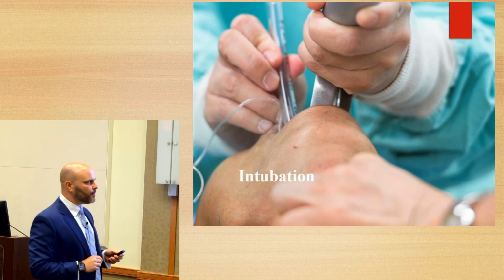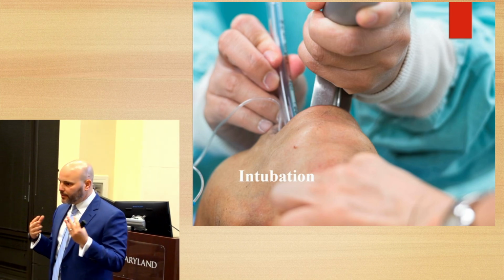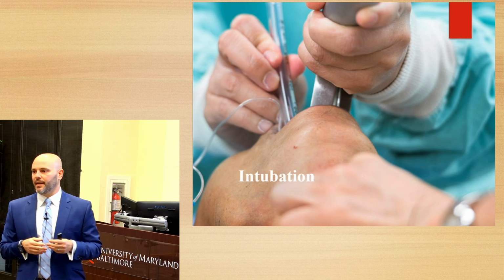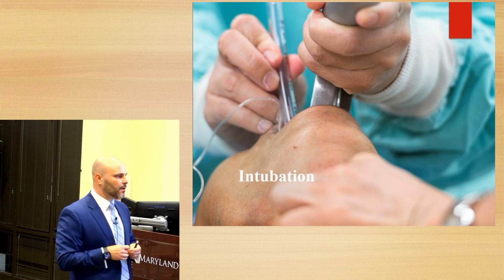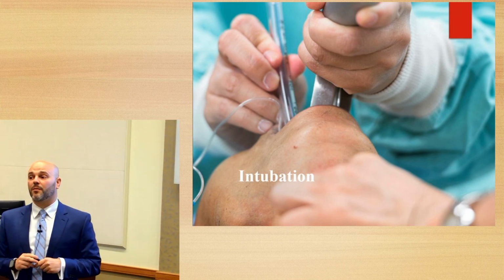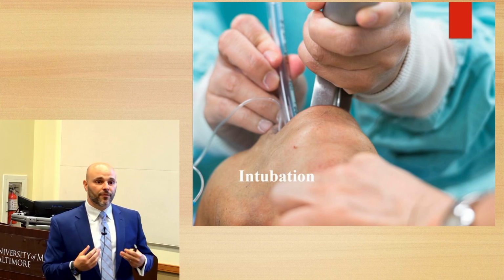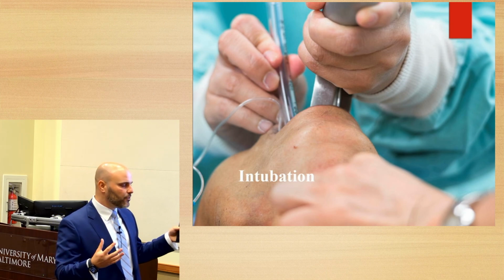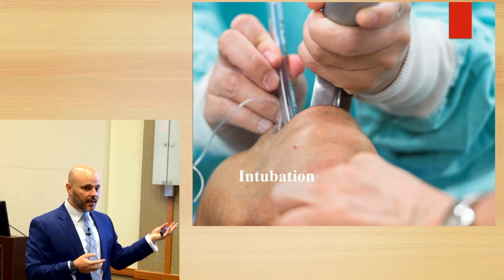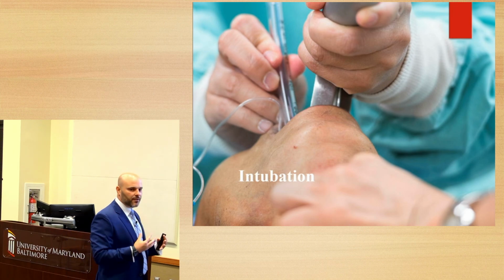Okay, so intubation. When we intubate, in New York, we receive a lot of preclinical intubations by EMS. And sometimes there are going to be some missed intubations as high as 5 to 10%, in some studies even 20% missed intubations in the field. And it's important for us receiving critical patients in the emergency department to identify missed intubations or esophageal intubations, and even in the emergency department. Critically ill patients, we want to identify if the tube is in the right spot.